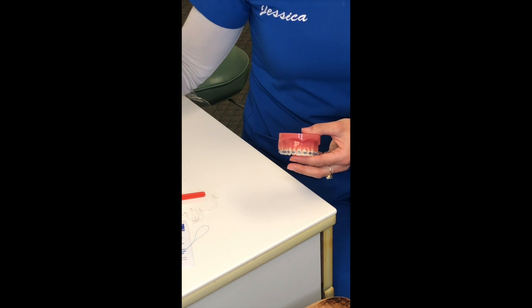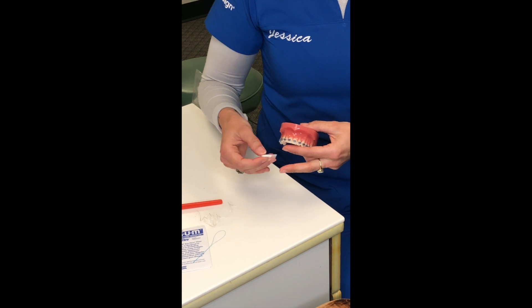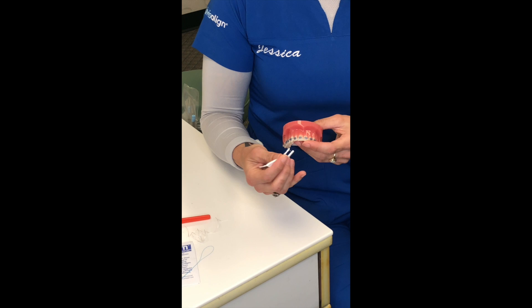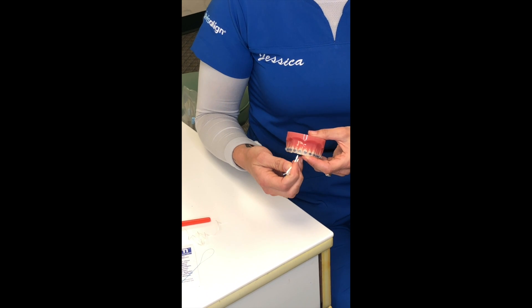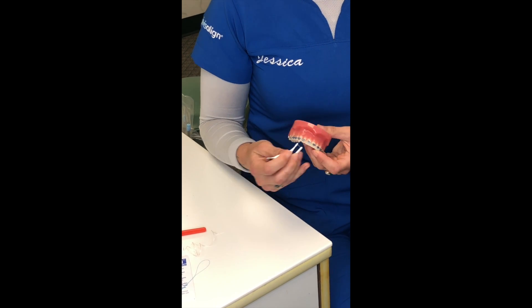Flossing is tricky because you have to do that for every tooth. So we also give you a sample pack of these — it's Platypus brand. You'll notice that one side is a little bit thicker and one's thinner. The thin side helps to get under the wire so you can floss each tooth really easily. These are a really good tool to have at home.